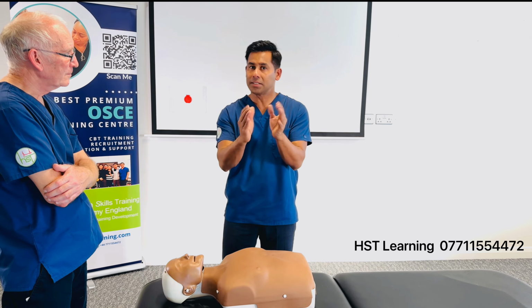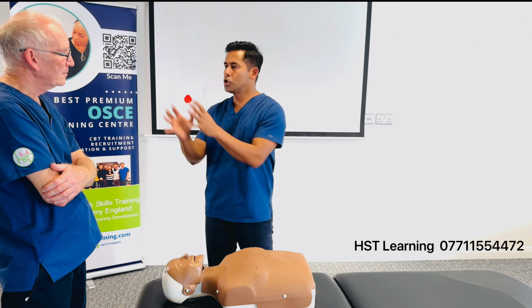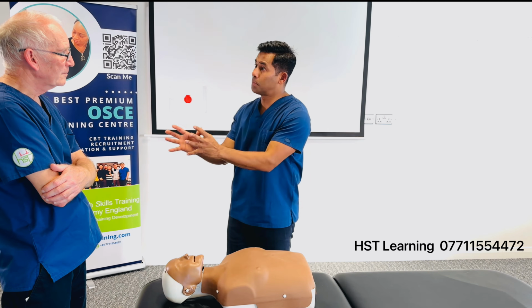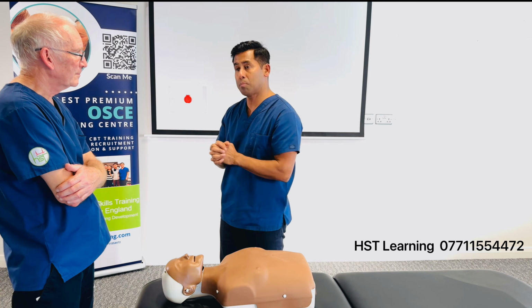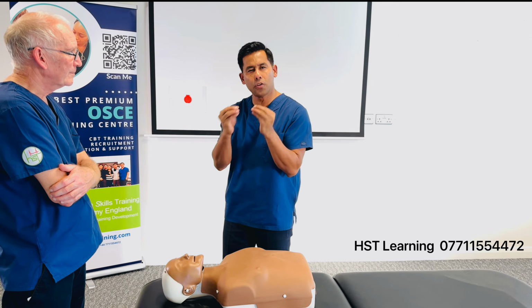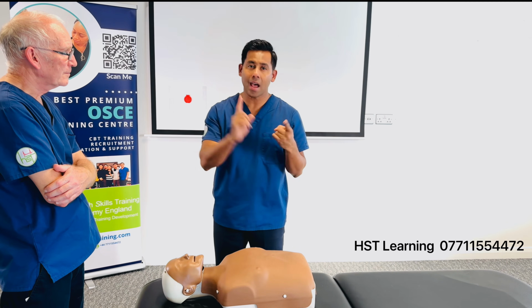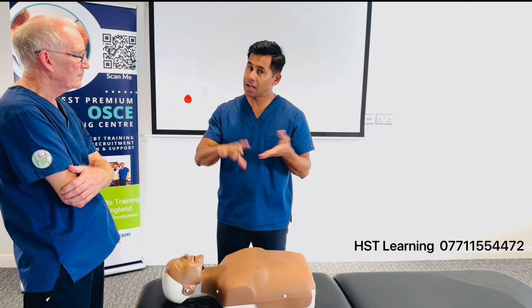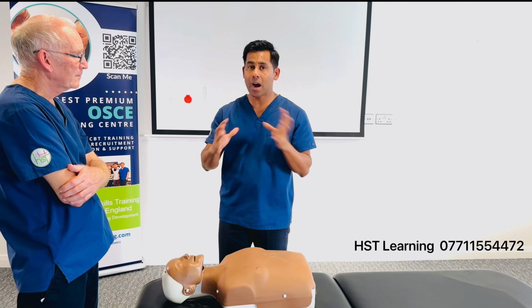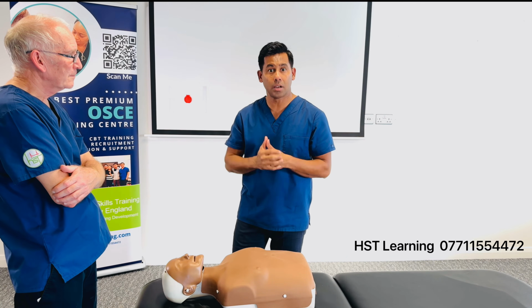All the equipment is there in that particular trolley. So you just need to mention, can you please bring the emergency trolley, which is a red trolley, and can you bring the ambu bag and oxygen? Even if you don't mention ambu bag and oxygen, if you say red trolley, that has defibrillator, that has ambu bag, that has oxygen, that has fluids, it is divided into airway, breathing, circulation sections in that particular trolley.